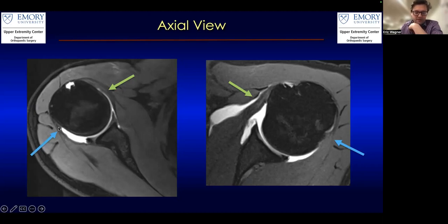But this is the lower part of the infraspinatus here, and you can see it's inserting onto this little flat area right here. So here's your joint surface, and then it stops right here. This is the part of the greater tuberosity, the lateral aspect of this greater tuberosity here. There's your biceps, as I said earlier, with the circle.